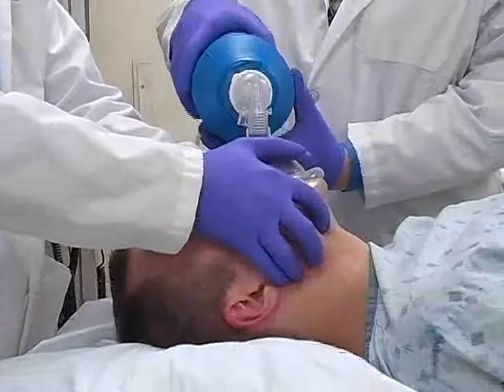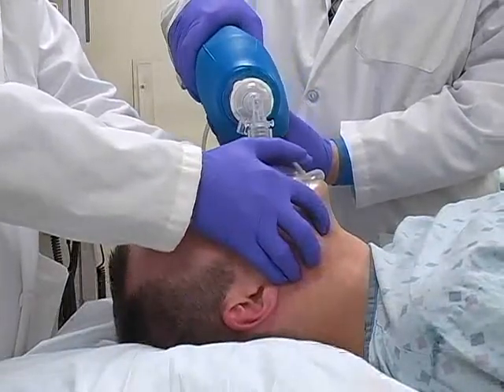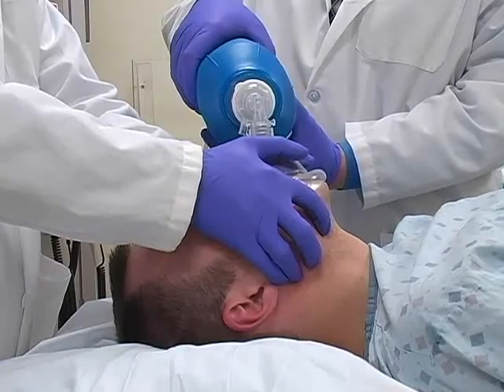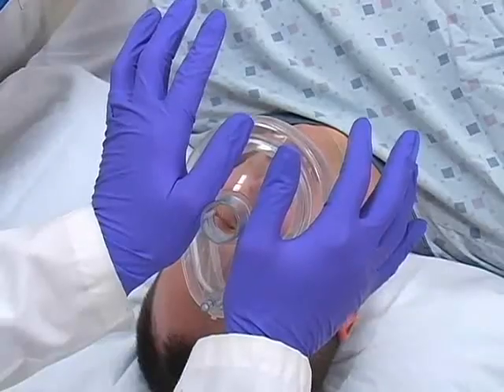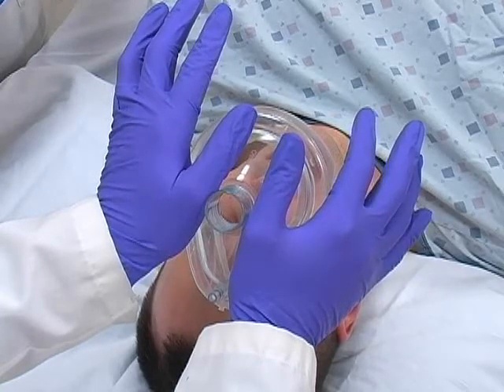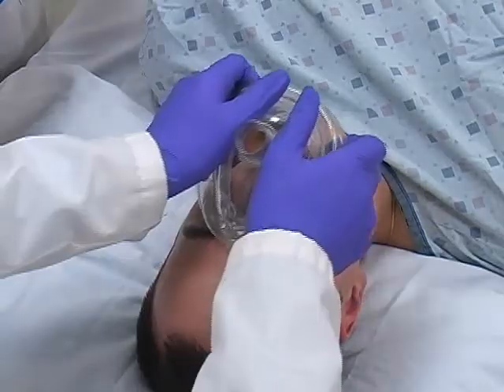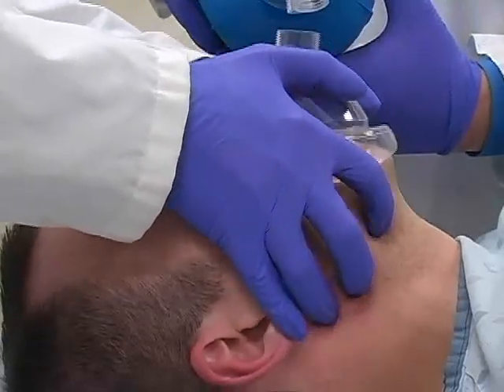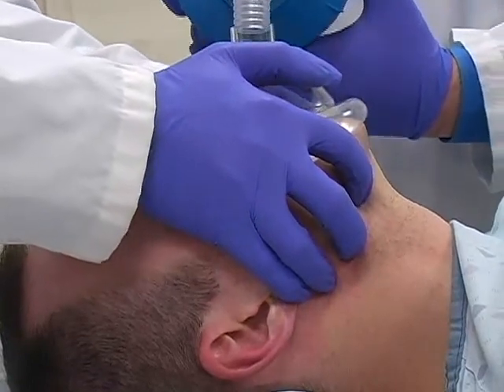An alternative method, using the stronger thenar eminences to hold the mask to the face, may be used if desired. The first provider holds his thenar eminences parallel to each other along the lateral edges of the mask. The mask is then lowered onto the face, and the fingers are placed along the underside of the mandible.